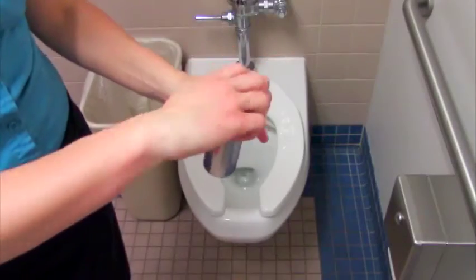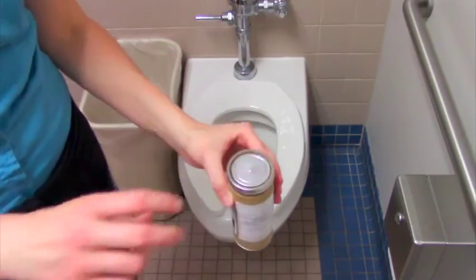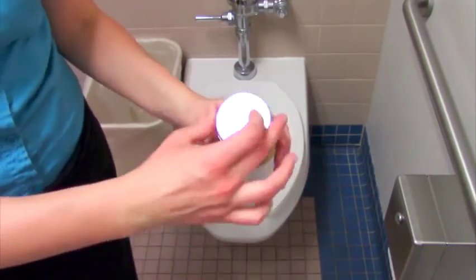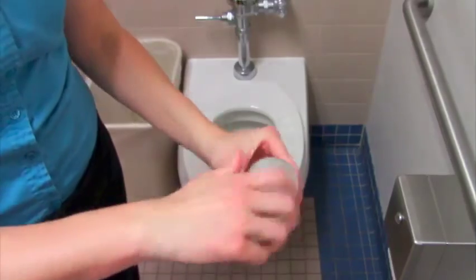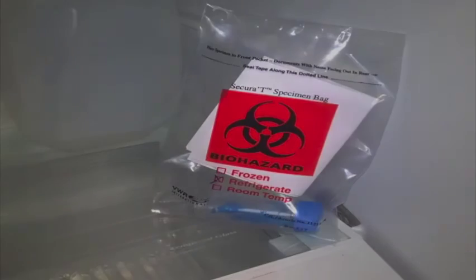Wrap the plastic container in the absorbent material and place in the metal container. Put the lid back on the inner metal container and place the metal container inside the outer cardboard tube. Do not write on the outside of the cardboard tube — this section will be completed by your local health department prior to shipping. Refrigerate your sample after collection if your local health department instructed you to do so.